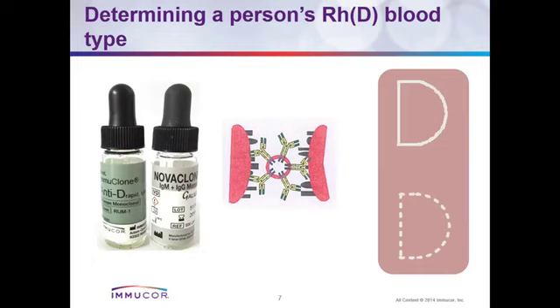So when we sent them back to NMS, they redistributed to other facilities. It could actually include yours. And many of our colleagues started reporting rhesus negative, yet it was actually a false rhesus negative as a result of the poor quality anti-D which was supplied to them.